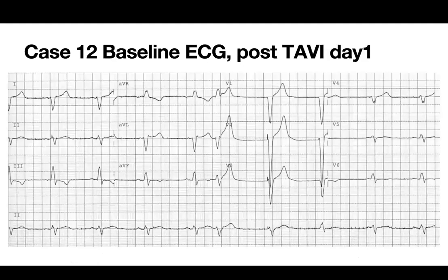Yeah. Go next. Sorry, I never thought about this until now, but I wonder if the impedance from the ring also tells you if you're in or not. In that paper, they looked at the impedance. As you're transitioning, they looked at ring threshold and ring impedance. But in the end, I don't know how useful it is because the changes are so small. So they use it instead of contrast injection.